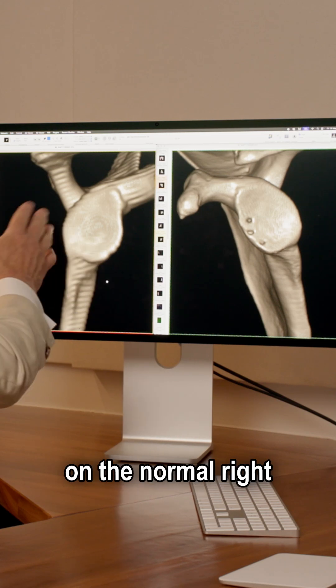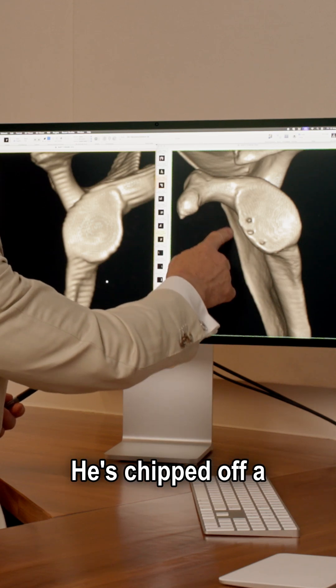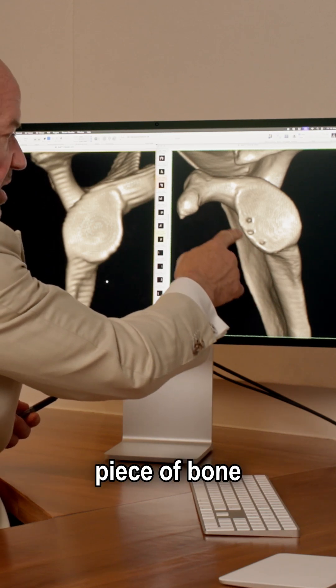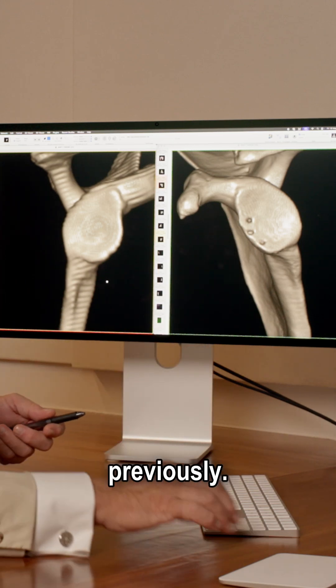You can see an obvious pear shape on the normal right shoulder. The uninjured right shoulder—on the left shoulder it's no longer pear-shaped. He's chipped off a piece of bone at the front of the shoulder here. You can see anchor points from the three anchors being placed previously.